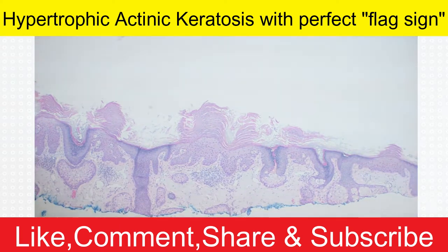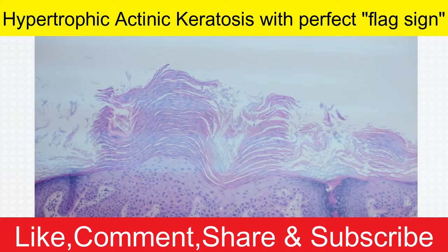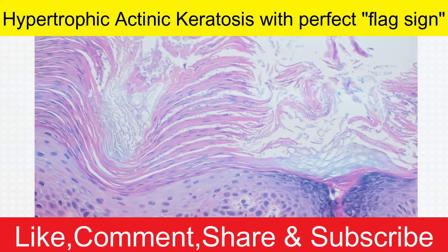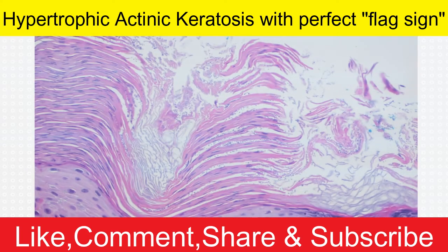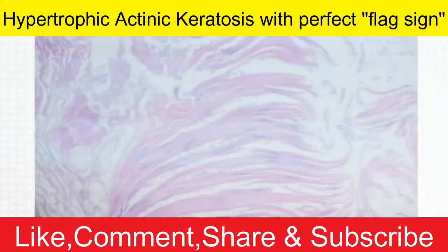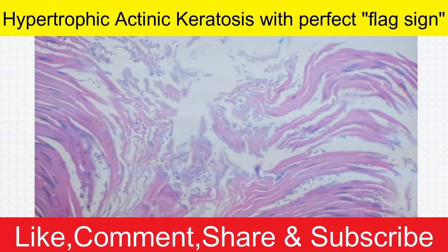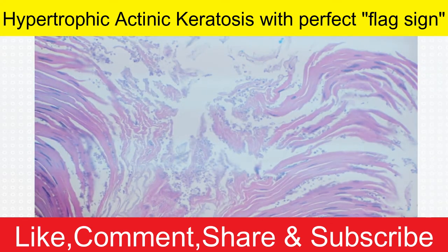And the final little bit of information we'll extract from this simple bread and butter case is that anytime you've got a real thick corneal layer, whether it's ortho or para, you do have a tendency to get some little guys that come to hang out in here and grow. And so these round structures you're seeing here, it's a little hard to get them in perfect focus. These are yeast. And these are not causing any problem. They're just commensal organisms just hanging out here and eating the oils, the sebaceous secretions of your skin drain to the surface. And that's why skin gets oily.